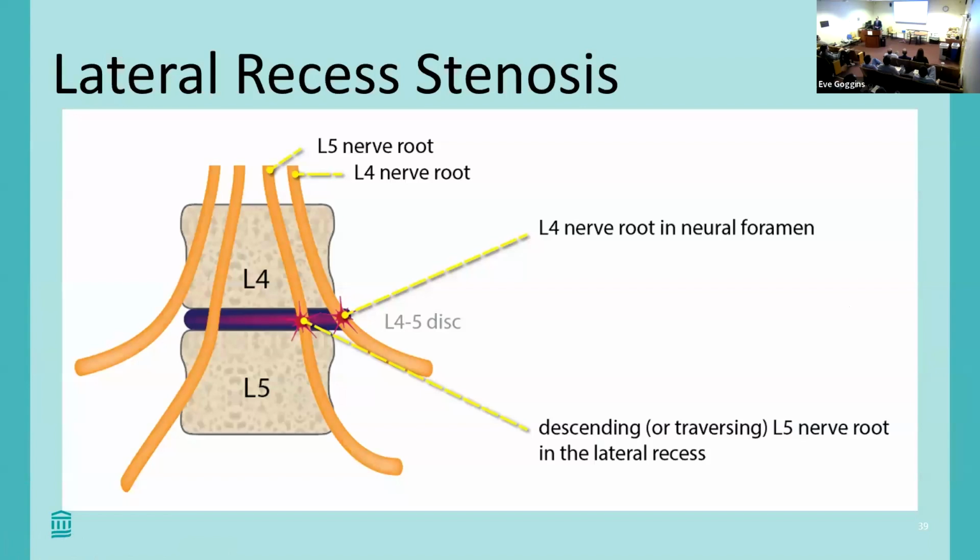Okay, so now I'm going to talk about lateral recess stenosis. This is what I mentioned in the beginning as one of the hidden corners. So again, we'll talk about the schematic. You guys all know this, but it's still important to take another quick look at.